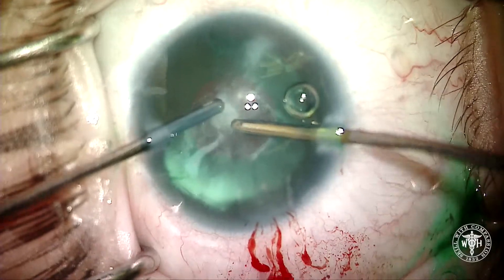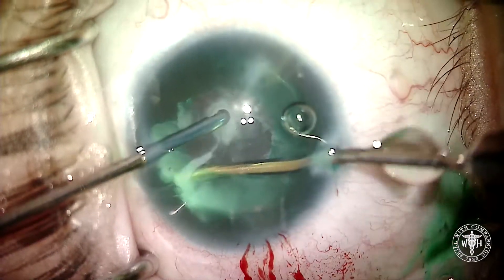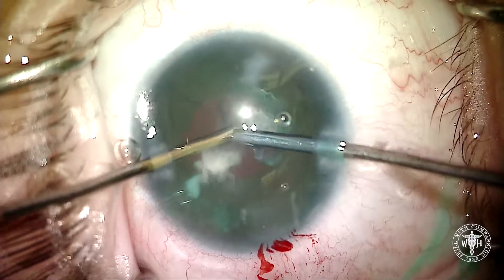I ended up getting a complete capsulorrhexis, but I wasn't real happy with the size. I thought the relatively small capsulorrhexis may make it difficult for putting the artificial iris in down the road, so while we've got it, we might as well finish taking out the cataract.